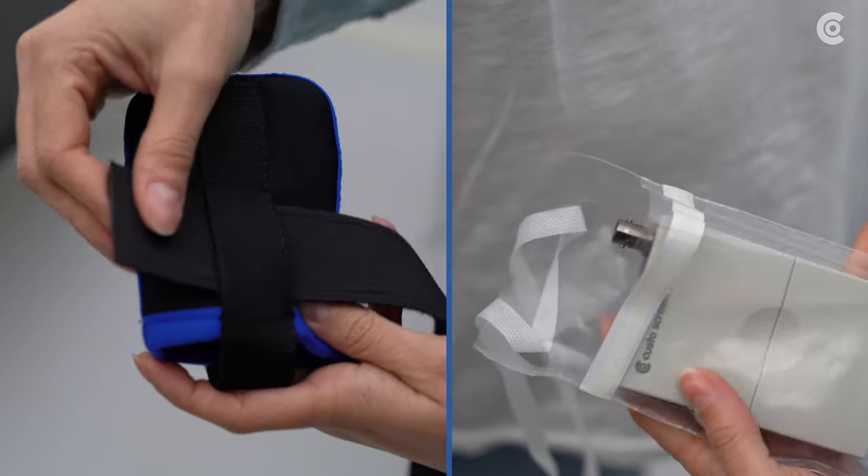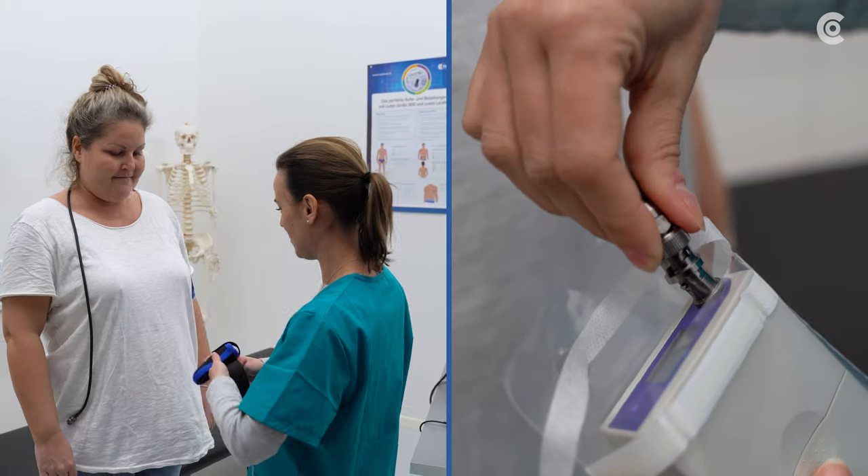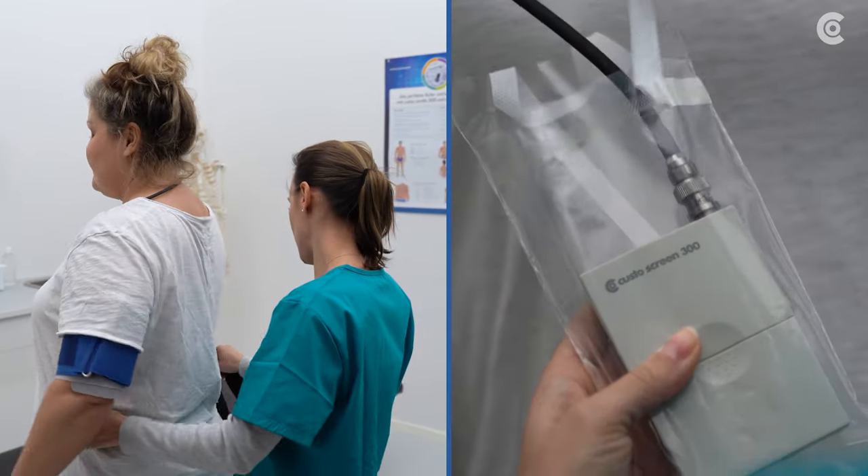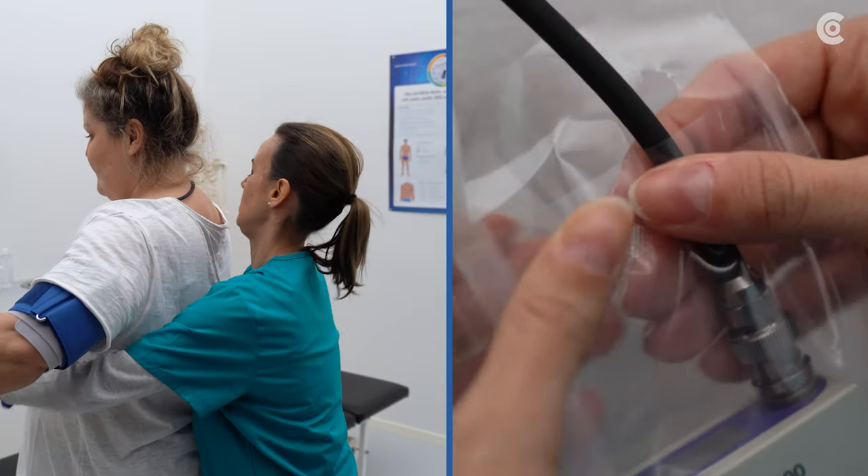Put the recorder in a CustoClean hygiene bag or a customary CustoMed bag. Connect the Screen 300 to the blood pressure cuff and attach it to the patient.